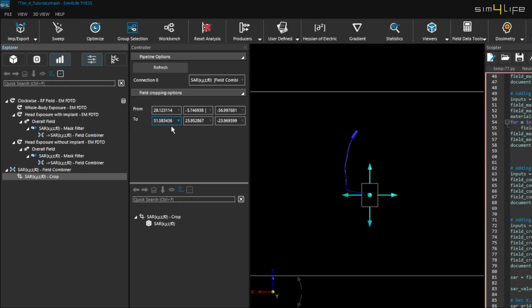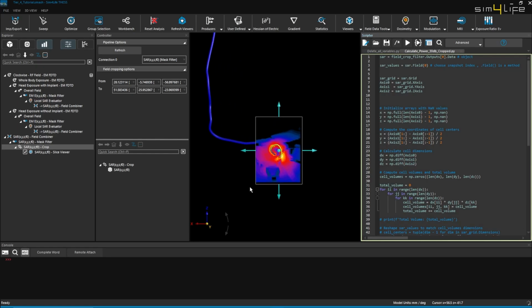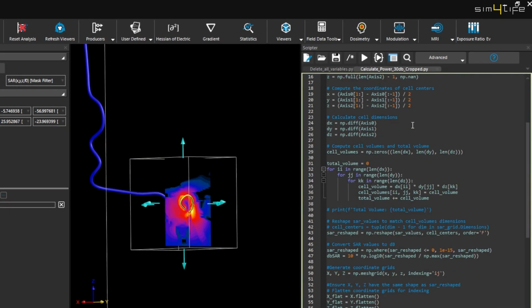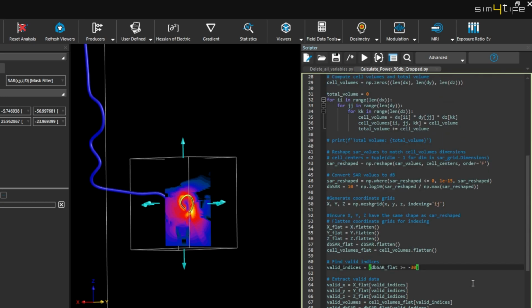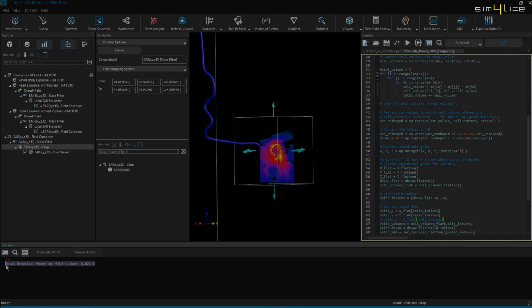Sim4Life menu. In the scripter, divide each SAR value in the cropped volume by the maximum SAR value and convert it to decibels. After converting the SAR values, find the volume where the SAR is greater than -30 dB. Finally, to calculate the total deposited power around the tip, integrate the SAR values in the -30 dB volume. The result is printed on the console. Note it down to move on to the final step of normalization, to the whole body SAR and B1+.